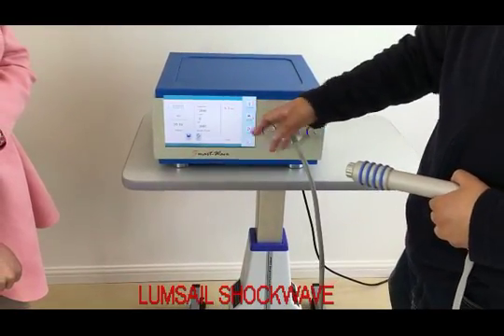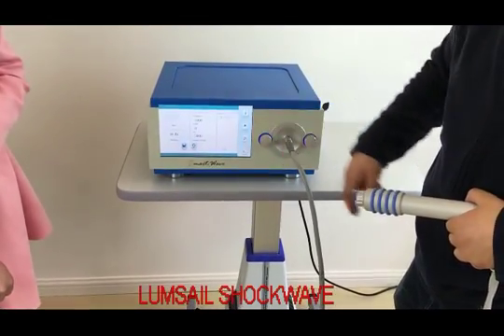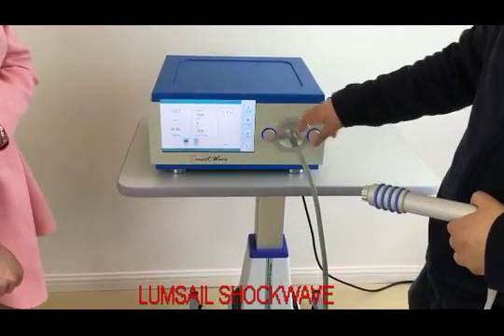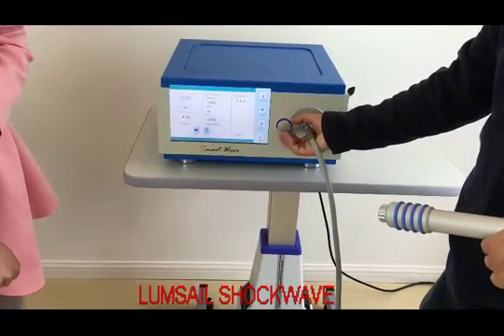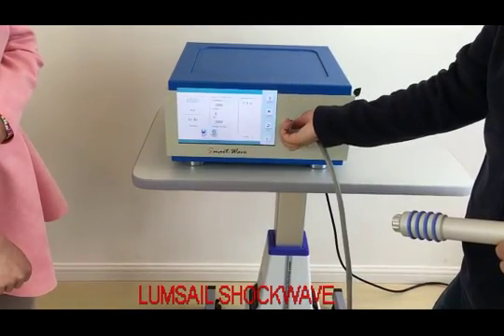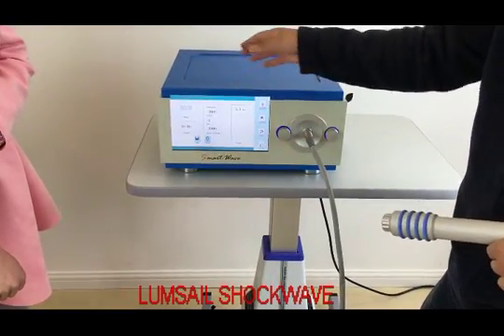In the treatment menu, the default setting is frequency 10 Hertz with energy 3.1 bar. Bar is the unit of air pressure. You can use the two knobs to adjust the frequency or the energy. For example, I turn the knob and you can see the frequency drops. If I increase, the frequency can go up to 21 Hertz, and we reserve the frequency up to 22 Hertz.